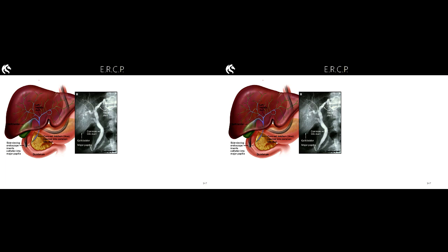An ERCP examination is going to have a patient in a twilight level of sedation. They're going to need to understand some basic instructions, because in an ERCP examination, the endoscope is put into the patient's mouth. From there, advanced into the pharynx. The patient is encouraged to swallow that scope down. We're talking about a structure which is about 8 to 10 millimetres across. The patient will swallow that scope down, and that's going to be pushed through the patient's stomach and into the first part of the duodenum.